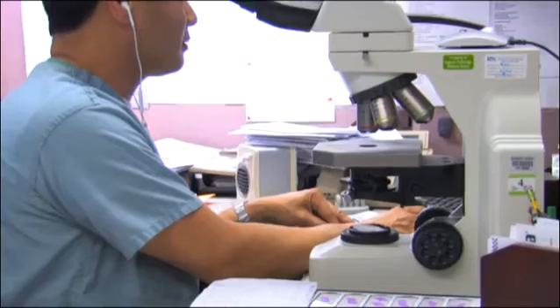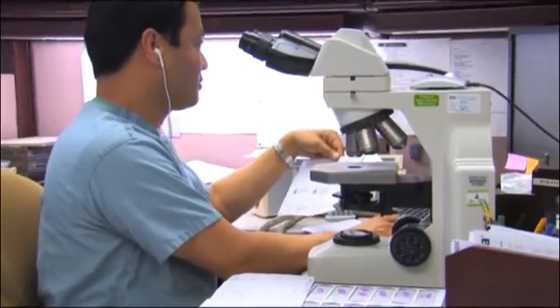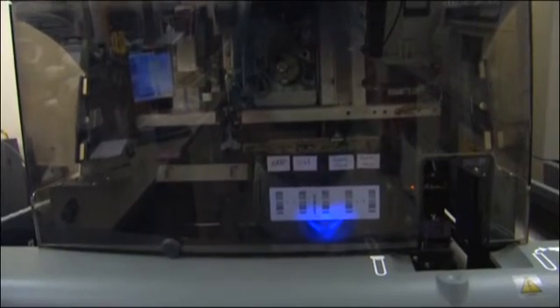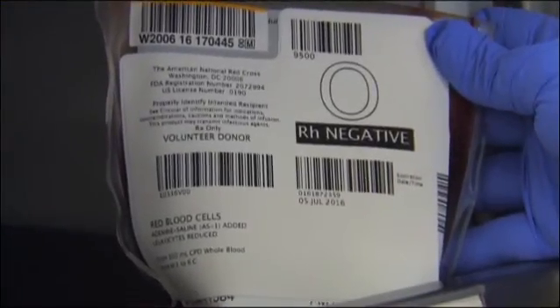Laboratory Services performs tests on blood and urine and body fluids so that we can help the physician treat and diagnose diseases. We have a number of different areas in the laboratory. We have chemistry, we have hematology, both of which are very automated departments, and we have blood bank and microbiology, which are the more manual departments.